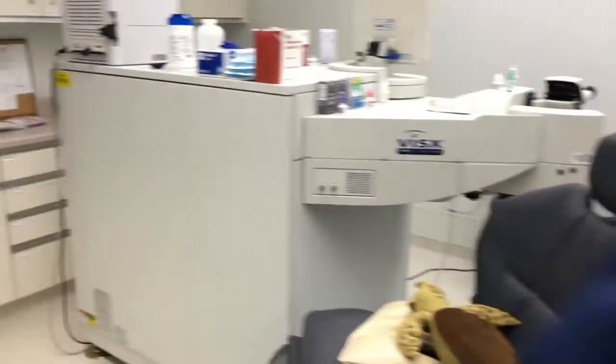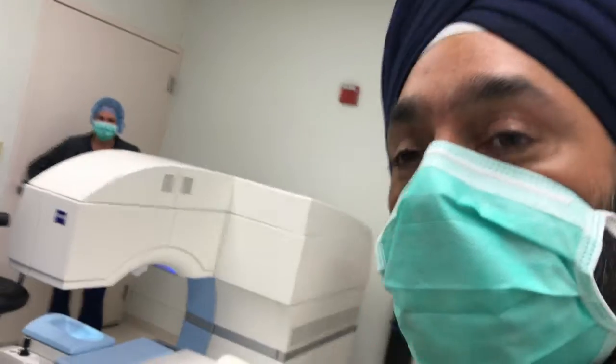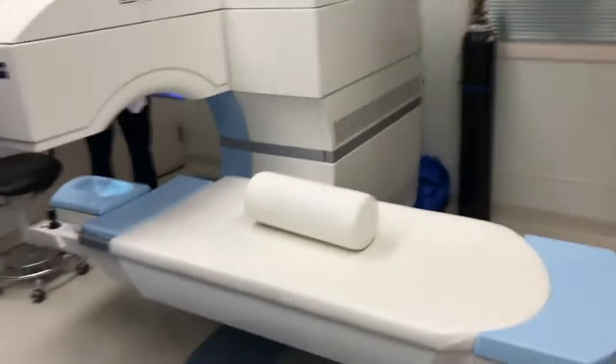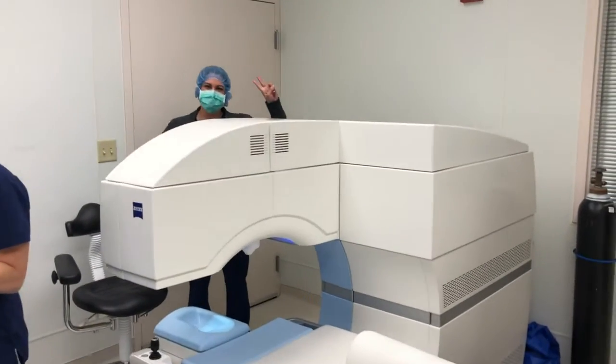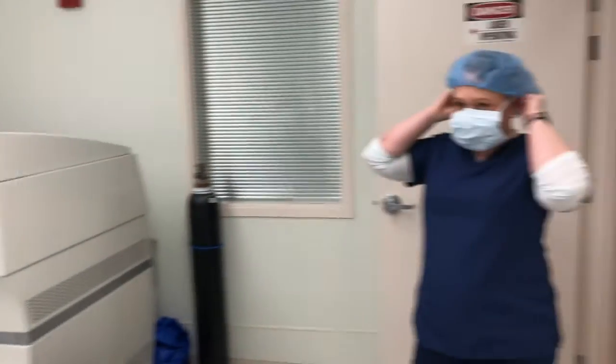We've got Lisa here. We're going to do SMILE — this is our first time doing SMILE surgery. We've got the Visumax there. Our first case — it's about time. We'll make people smile today. All right guys, let's rock it, here we go.